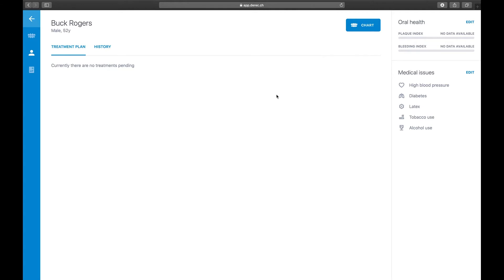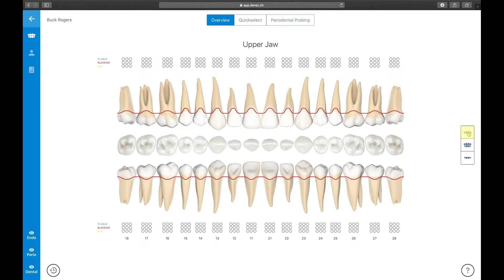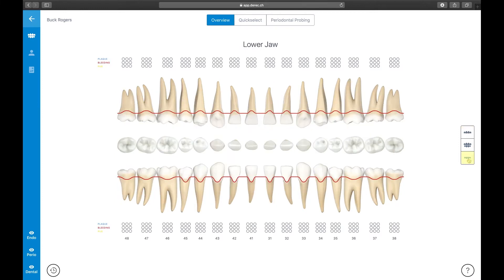Let's jump into what Derek is mainly designed for: the dental charting. Click on the Chart button next to the oral health section. The chart view is Derek's core functionality. When you first enter the chart view, you will be presented with an overview of the upper and lower jaws. We created three different views: the overview, showing the buccal and occlusal aspects of the teeth in the upper and lower jaw, and the upper and lower jaw views displaying the buccal and occlusal aspects of the teeth. This is very useful for periodontal evaluation.